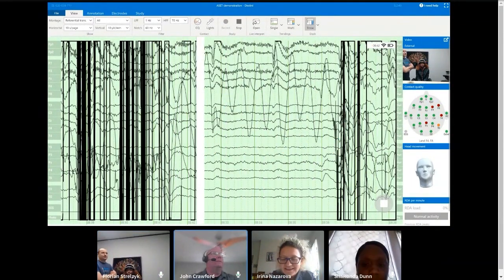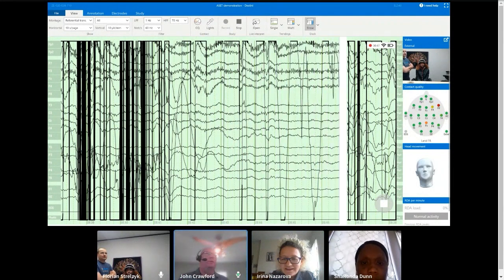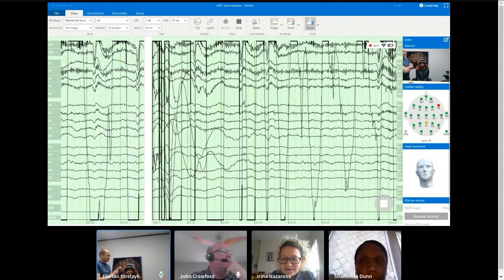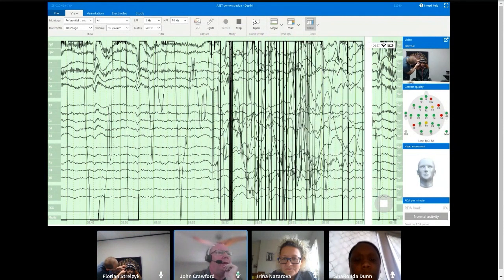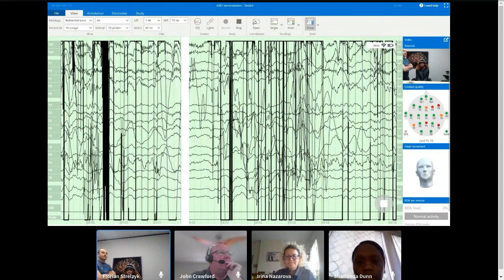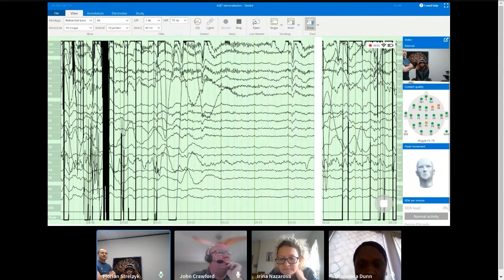And hey, Florian, sometimes it helps to move that slider back and forth just a little bit, maybe to a 2 setting or a 4 setting. Yeah, I hear you. Because sometimes that'll push the hair sideways too, so you can have a little bit of a lateral motion there to help with that. Yeah, I just did that. That was a secret. Thank you, JC.